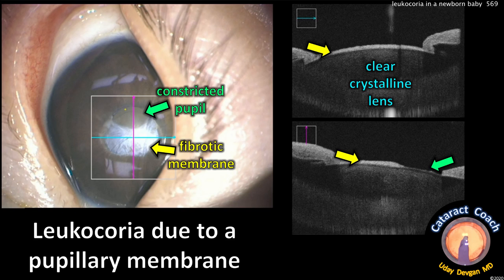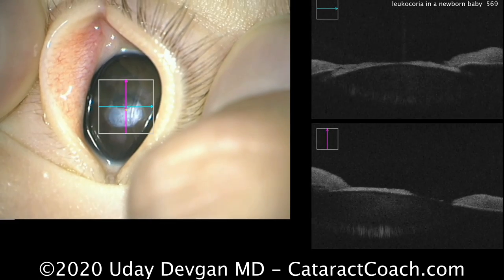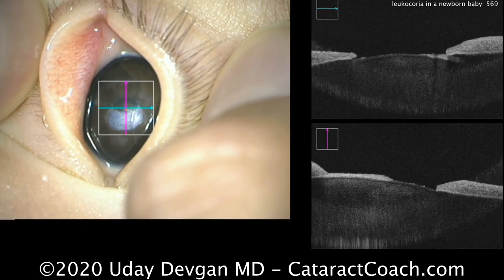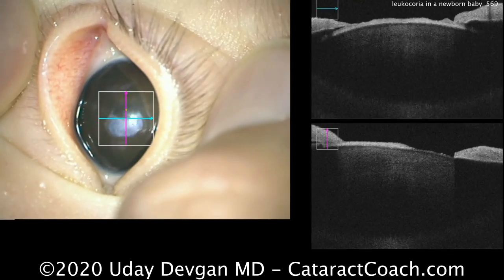Let's look at the OCT image. We see there's a constricted pupil and a fibrotic membrane blocking most of the pupil. The crystalline lens actually looks pretty clear, so there does not appear to be a congenital cataract. Looking at the live OCT image, you can see a nice, clear crystalline lens. There is a fibrotic membrane blocking most of the pupil, but a little bit of the pupil is remaining, which does allow light to penetrate into the posterior segment.